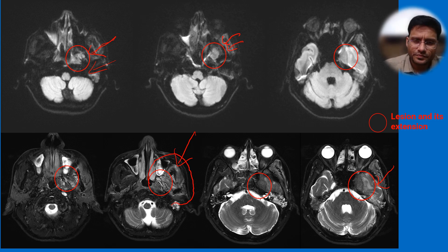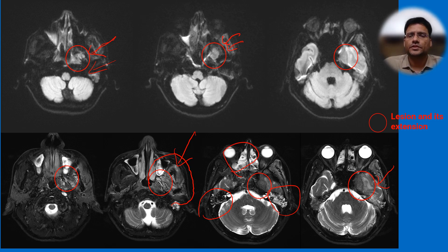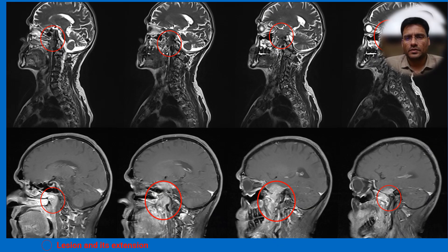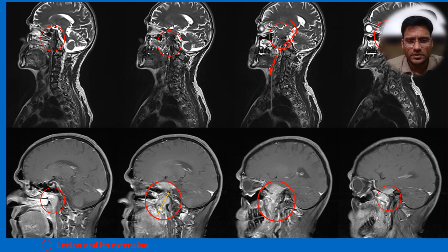There is edema in the masticator space and infratemporal fossa. There is also bilateral mastoiditis and sinusitis. So there is a mass in the nasopharyngeal region which is involving the skull base and cavernous sinus, with subsequent temporal lobe invasion. If you see carefully, this is a continuous process involving the pharyngeal region, which you are able to appreciate on contrast as well — there is direct spread of the lesion from the nasopharynx into the cranium.